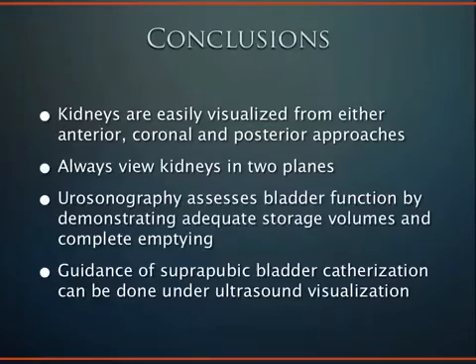Think about using ultrasound whenever you think about the bladder, and you can see the storage volumes, you can see the post-void residual, and of course guiding suprapubic bladder catheterization. Like any other time when we take a sharp object and we put it into somebody's soft tissue, we can use ultrasound guidance for that.